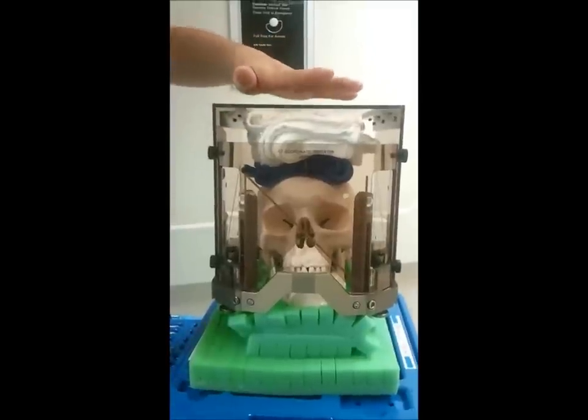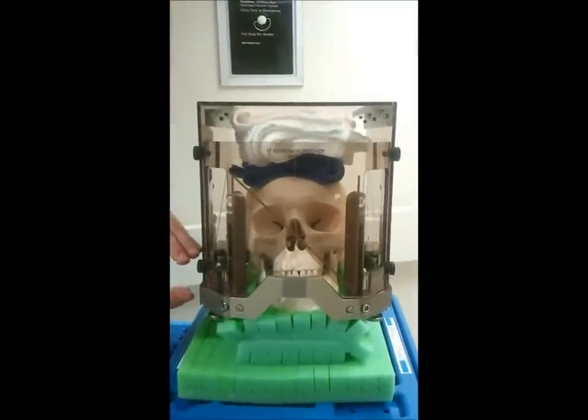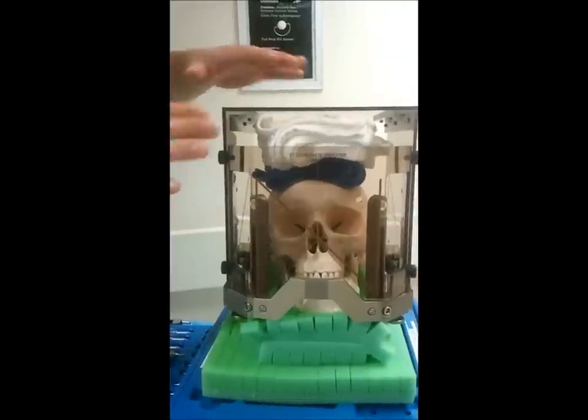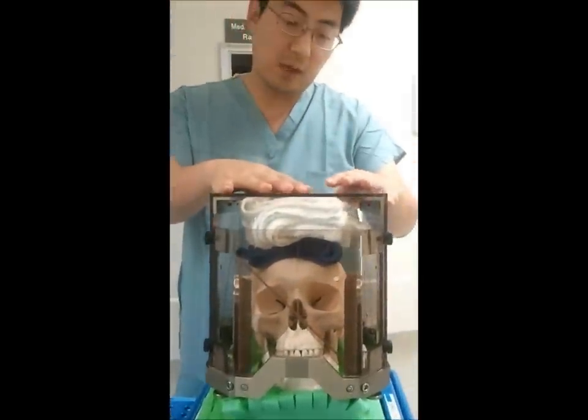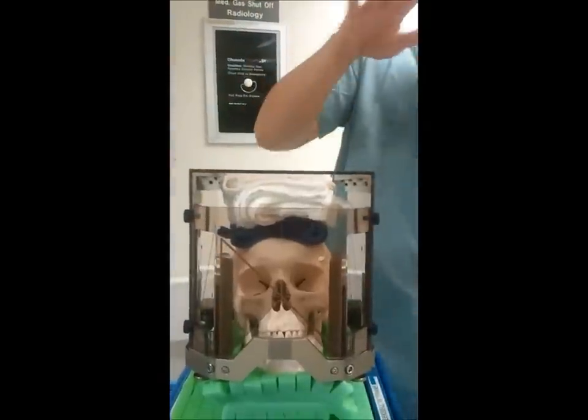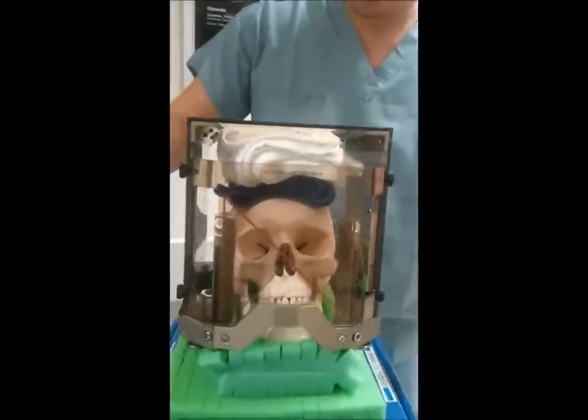The CT frame is quite a bit taller as far as superior height above the base of the ring. With the MRI frame, you don't need to build it up as much, but this technique helps prevent you from placing — especially the MRI frame — too low to where you cannot get it fixated on the skull.